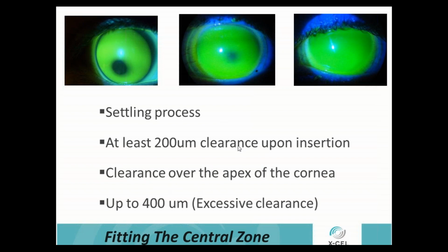And what we say in our fitting is 200 to 400 microns. If you fall within this range, that's the wheelhouse. That's going to give you supreme comfort and visual acuity. So if you fall within that range. Now, sometimes you can start out with more than 400 microns. Again, you're going to see some of that settling.